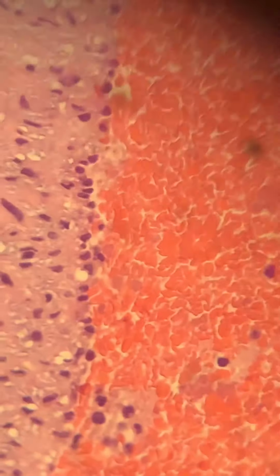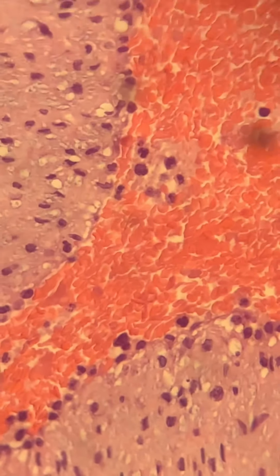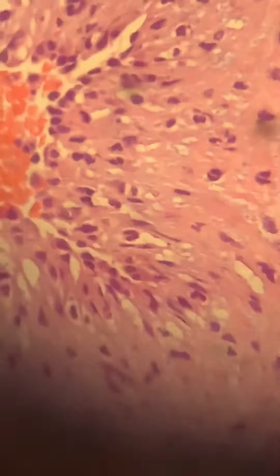If I can keep it in focus, again, I need to get me a fixed projector, but you can see some polys in this umbilical vessel. So that would be diagnosed as acute funisitis. Inflammation involving the umbilical cord and its blood vessels is called acute funisitis.